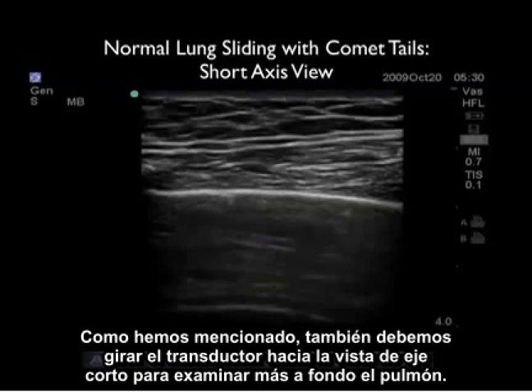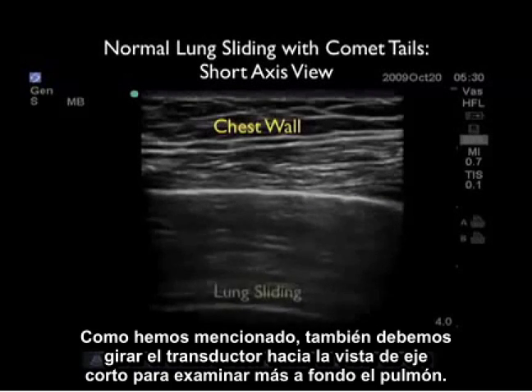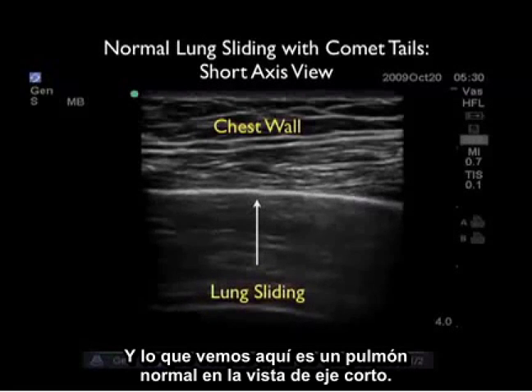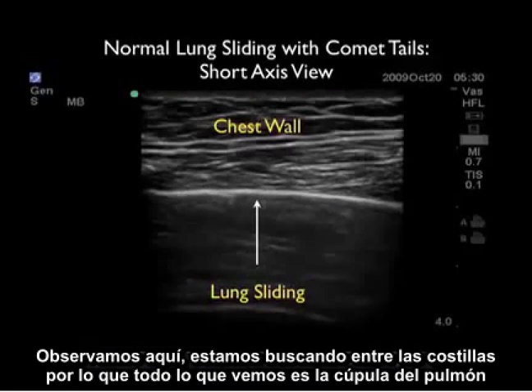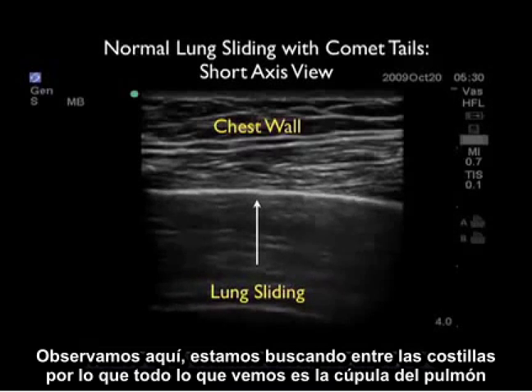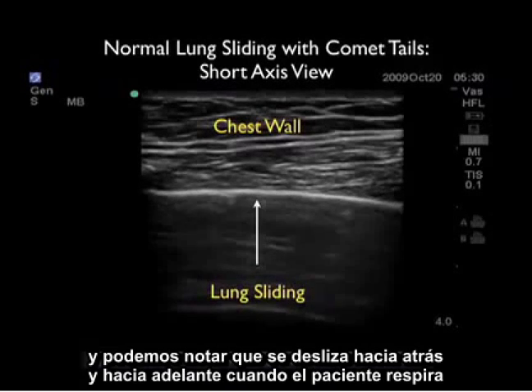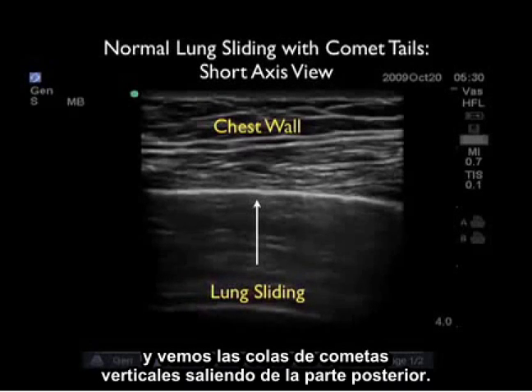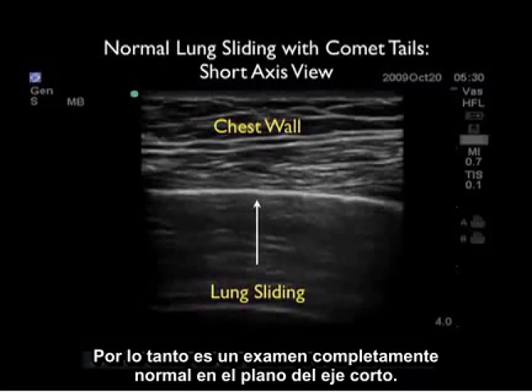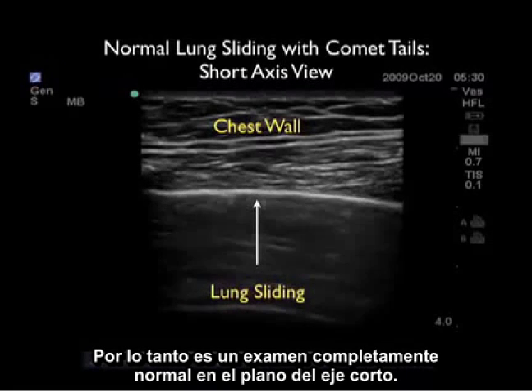As we mentioned, we should also swivel the probe into the short axis configuration to further examine the lung. Here we see a normal lung in short axis configuration. We're looking in between the ribs, so all we see is the dome of the lung, and notice that it slides back and forth as the patient breathes and we see the vertical comet tails coming off the back — a completely normal examination in the short axis plane.